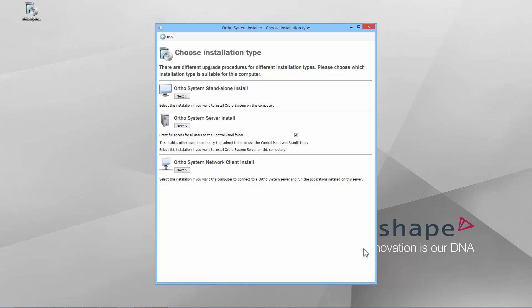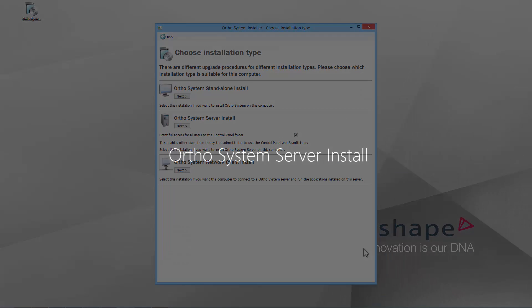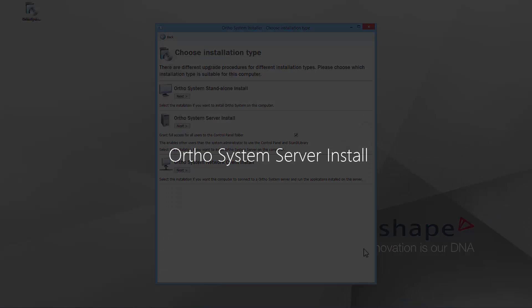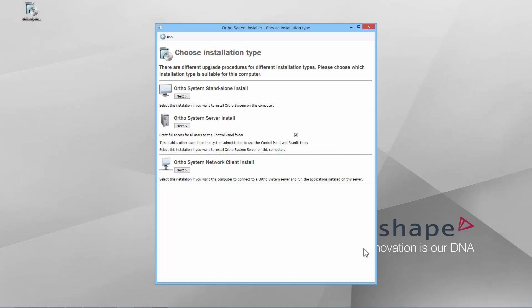Server install and client install are used for PCs connected via a local network. The PC that has all the installed applications and gathers all the data from them is called the server. Server installation acts like a standalone with UNC paths and the client PCs point to those paths. Application folders and OrthoData will be shared in the local network and full control over them should be set for everyone. Click the Next button in order to choose OrthoSystem server install.